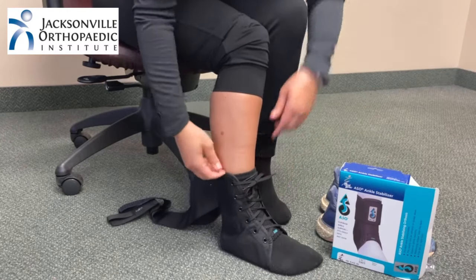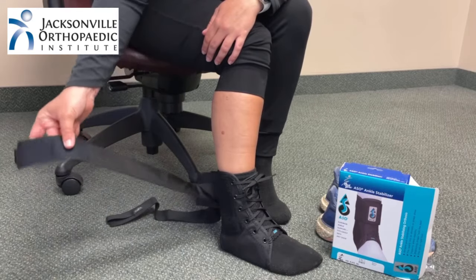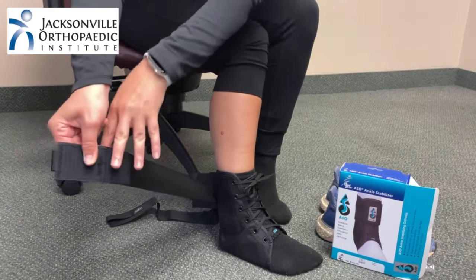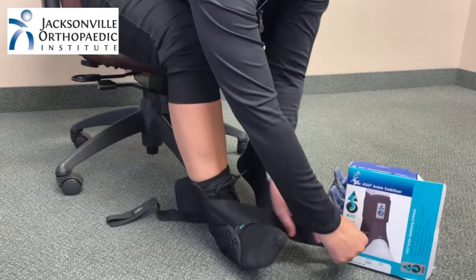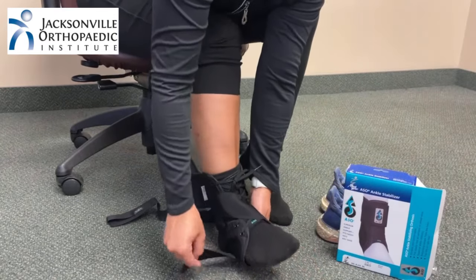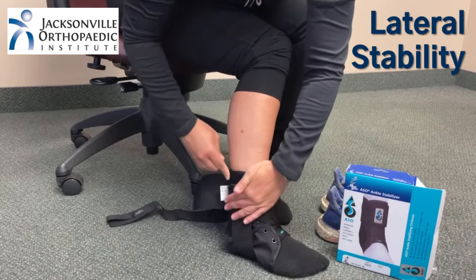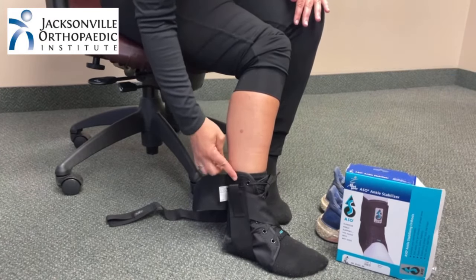Since most ankle sprains happen on the outside of the ankle, we're going to show you how to tighten the ASO from the outside. Start with the outside strap, reach across and under the foot, then pull it up the side — this will help provide lateral stability. Secure it by pressing the velcro.